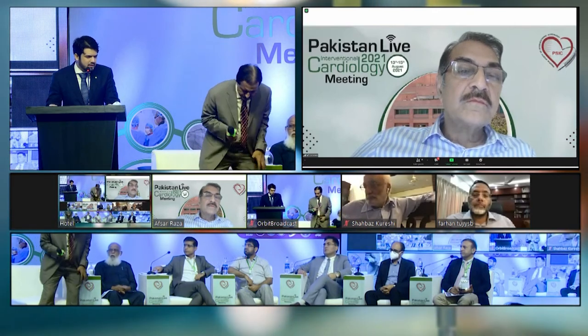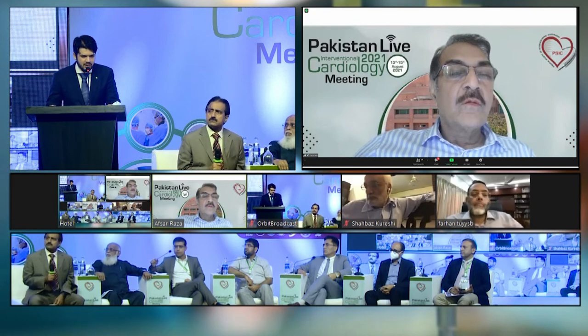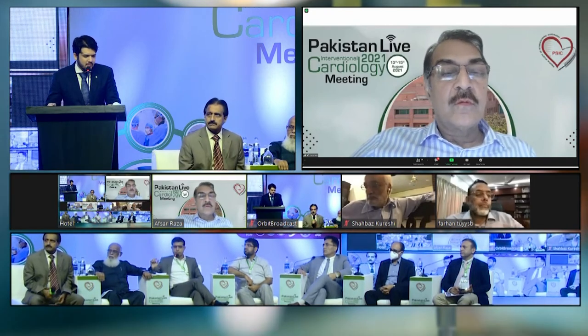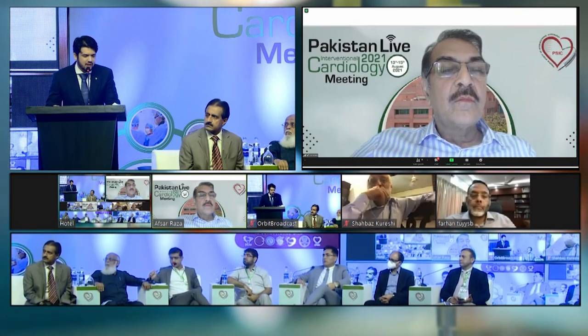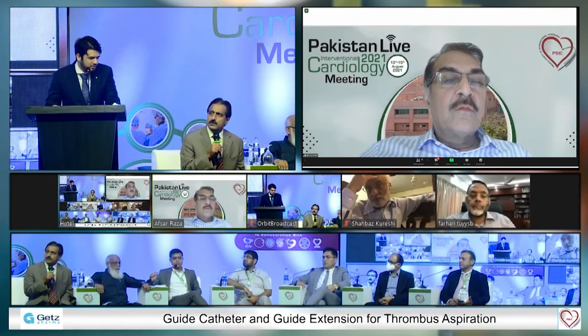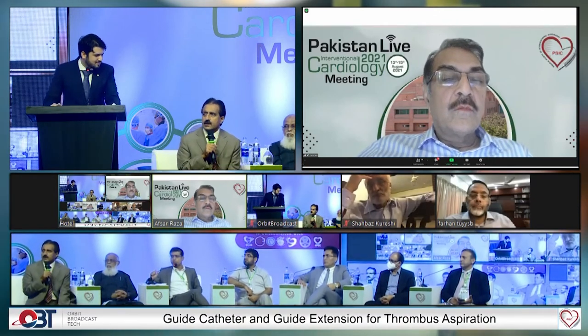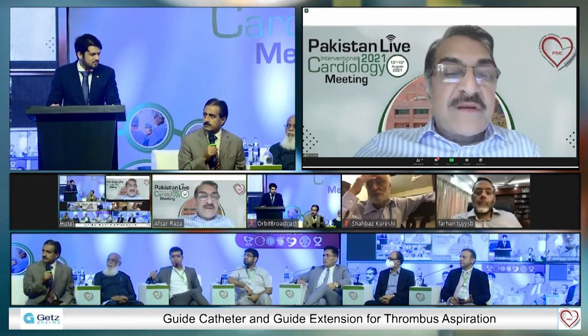So this patient did have a follow-up after 1 year, and he was fine clinically, but we did not do an angiography. Moreover, I agree, antegradely, if I had found the nub where the OM was arising, that would have been a bit helpful. These are ideal cases for retrograde as well, actually. There are good collaterals as well.